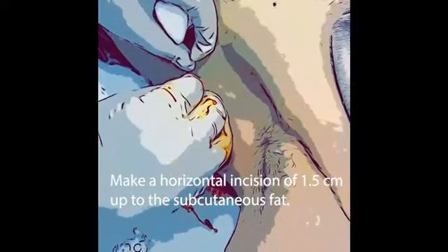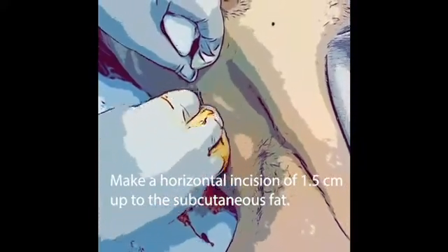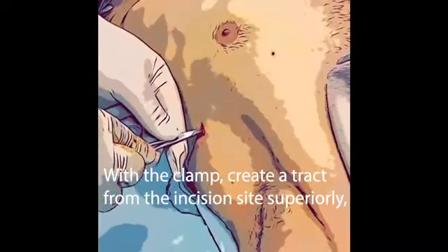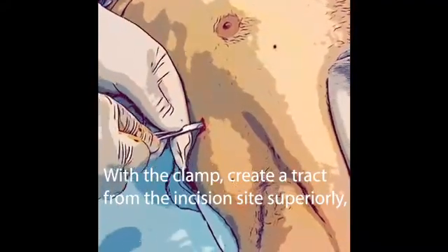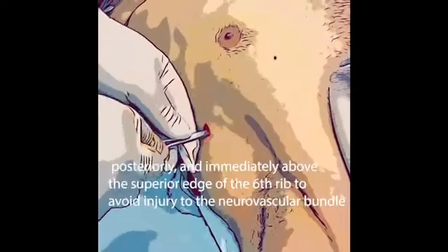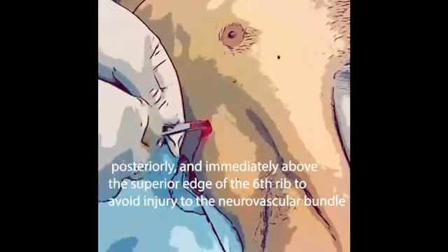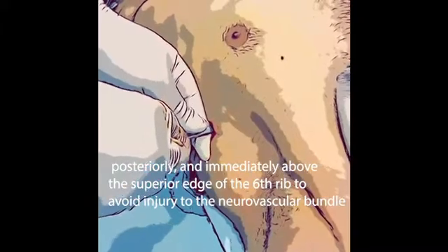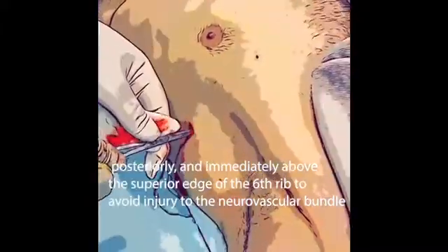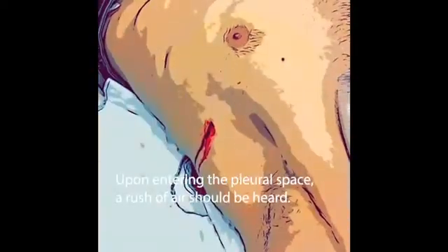Make a horizontal incision of 1.5 cm up to the subcutaneous fat. With the clamp, create a tract from the incision site superiorly and posteriorly.